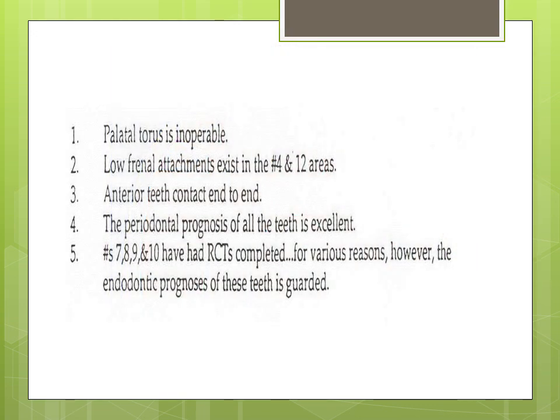Our first task is to obtain accurate diagnostic impressions, mount the casts accurately on the articulator, and survey the maxillary cast. To determine the path of insertion, we will examine the arch for potential guide planes, heights of contour, retentive undercuts, interferences to the path of placement, and the impact of aesthetics.